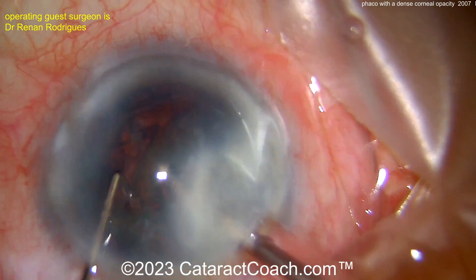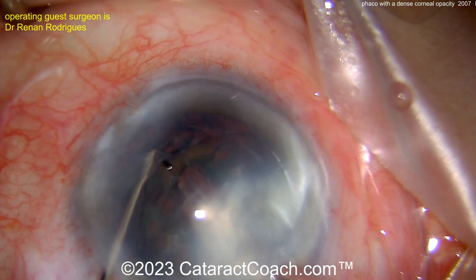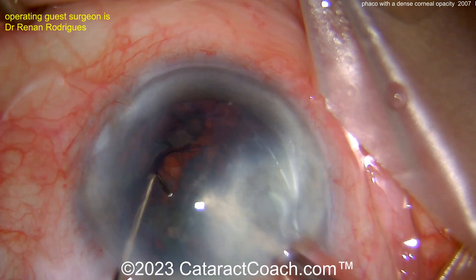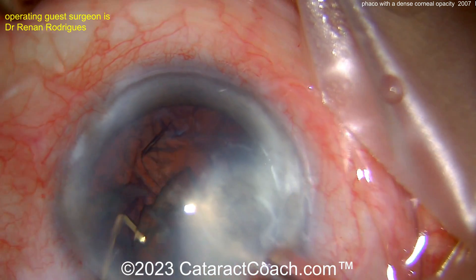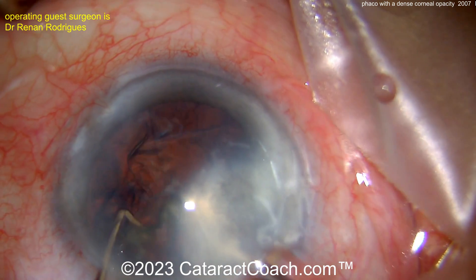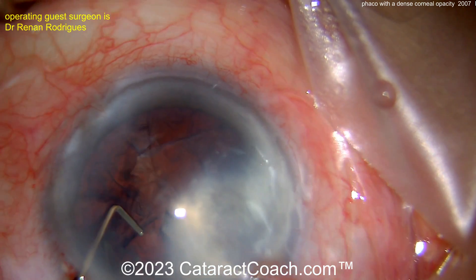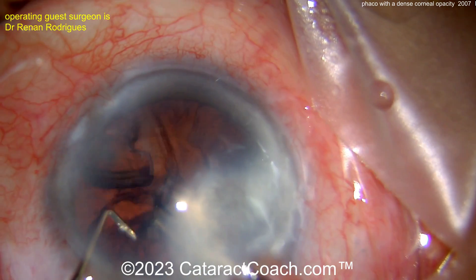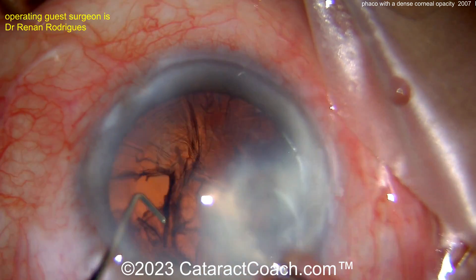Now let's talk about lens calculations. I'd look carefully at the central cornea — the central three to four millimeters. What's the average corneal power in that central zone? If you have any doubts, choose a lower corneal power. Because when you do the lens calculations, that'll cause you to choose a slightly higher power IOL. If the cornea is a little weaker, the IOL needs to be a little stronger, and therefore the error is going to be on the side of myopia.